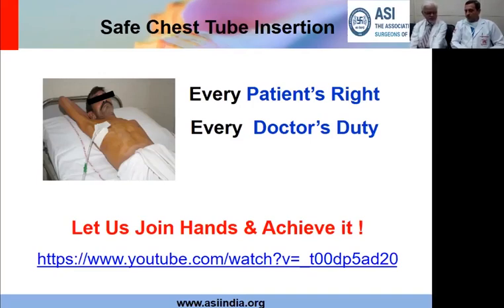One of the complications which can be very unnerving to a young doctor is bleeding from an intercostal vessel. So if that were to happen, what would be your advice to such a doctor and how to manage it? Yeah, so best is to avoid these complications by just paying attention to basic steps. If you palpate the ribs and the intercostal space and site your cut and your entry puncture at the upper margin of the lower rib rather than at the lower margin of the upper rib, which is where the neurovascular bundle is running, I think you would avoid inadvertent injury to this. But should that happen, the patient may bleed outside or may bleed inside.